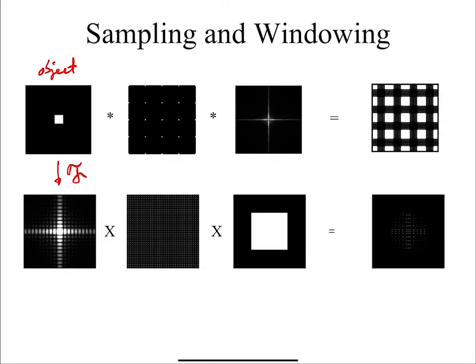Now, the sinc function, we don't necessarily want to sample it infinitely finely or go out too far in k-space. So we're going to make 2 operations. One, we have to figure out how to sample. So there's going to be some delta k of sampling, and that's represented by a multiplication. The sampling is multiplying by a comb function with spacing of delta k.